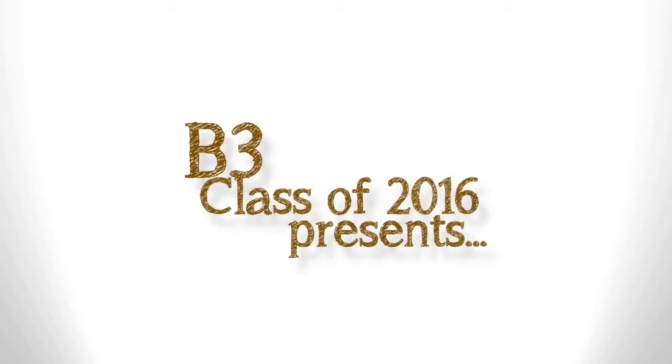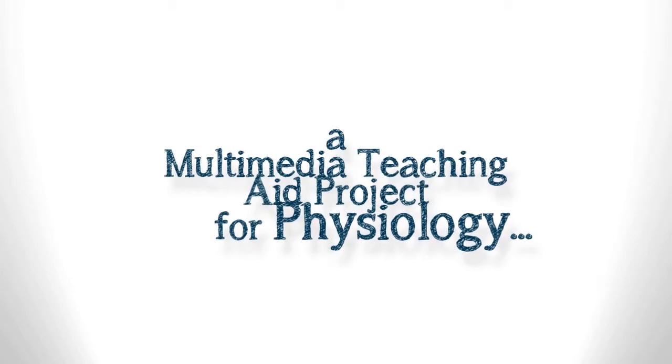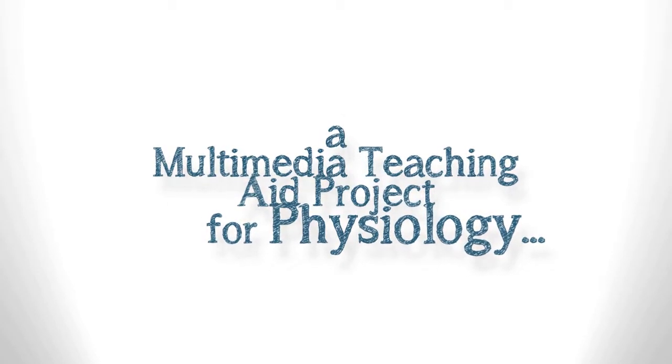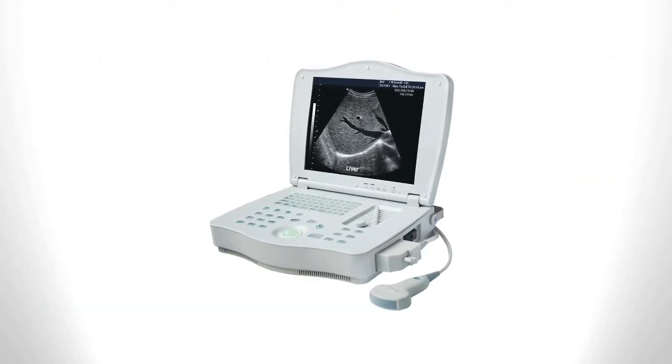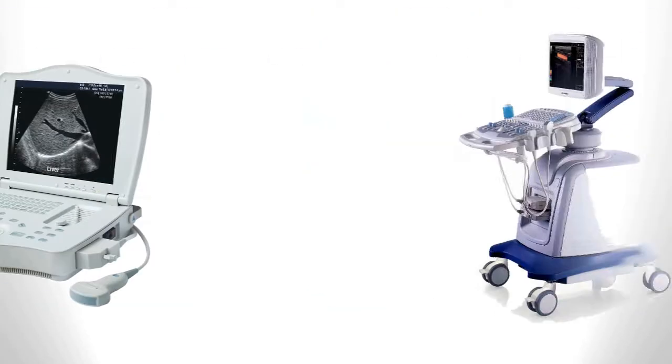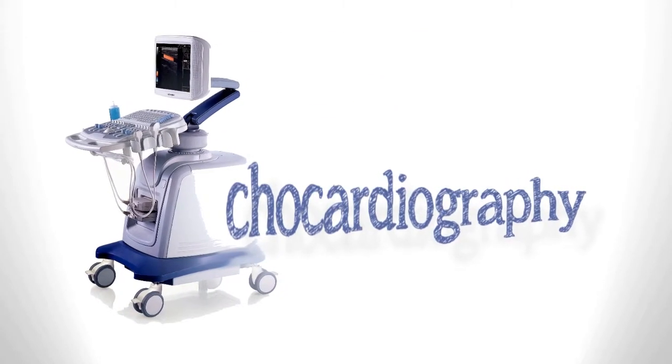With the recent advances, especially in the world of science, patients are slowly moving away from the days of painful invasive surgeries. Heart diseases have been on the rise and open heart surgeries have been the main intervention for a long time. However, primary cardiac practices seem to be changing with the introduction of painless imaging procedures. This is echocardiography.